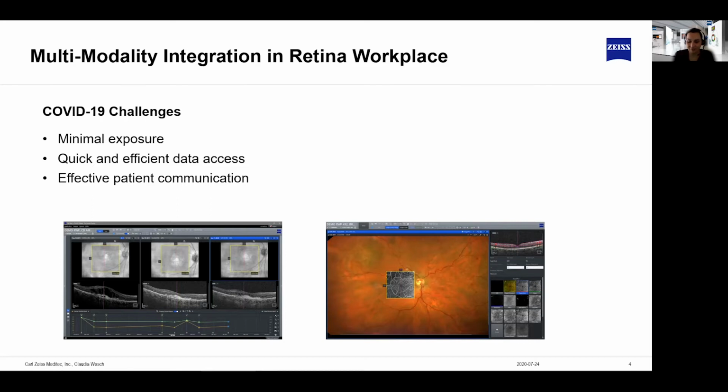We know that a lot of the patient communication today happens online, over video calls, over screen sharing calls. Of course, you can use the solution also using regular tools that have now become so popular, like Zoom, for example, to share information with your patient and visualize for them what you would like them to understand. But even more so, here it is very important that those tools are really effective, because you do not sit right next to your patient where you can even point with your finger to specific things, pull up different information on a screen or on paper, or pull up a model. It's important to just give them one screen and have all the information on there that they need to understand.